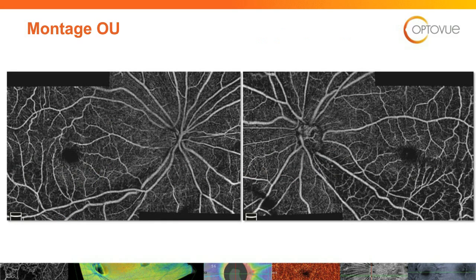And this is how we're able to show this to the patient. There's no measurements here, but this is really showing off to them how the capillaries are being damaged. It's that same patient. You can see that nice wedge defect coming off the inferior temporal of the optic nerve, and the inferior temporal of the left eye a little bit wider of a defect.